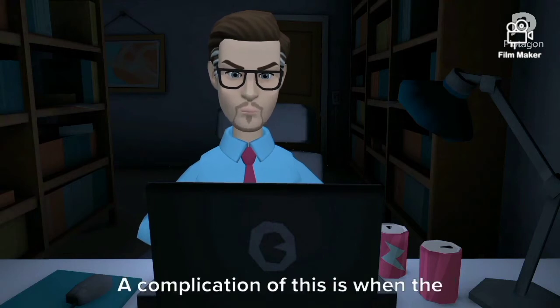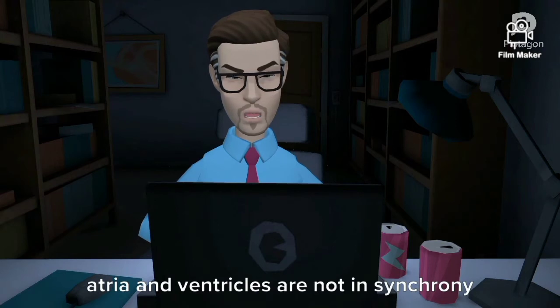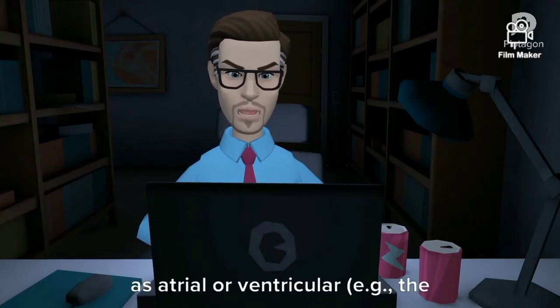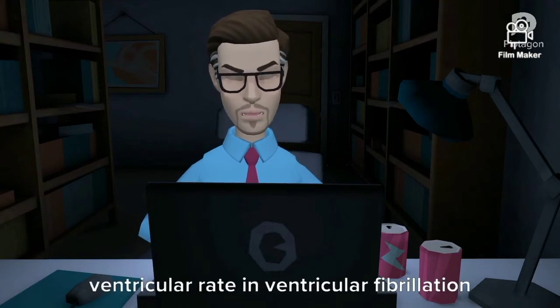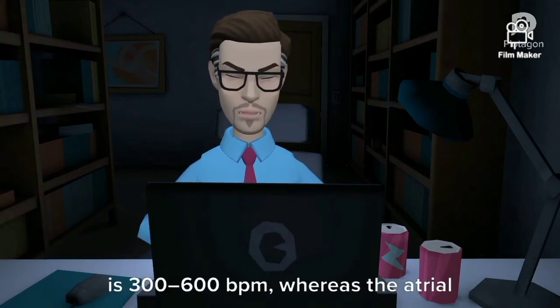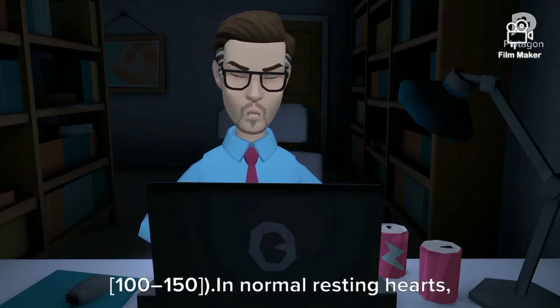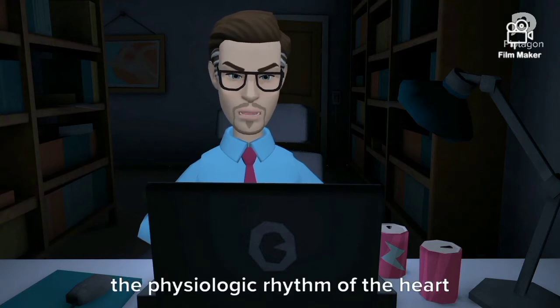A complication of this is when the atria and ventricles are not in synchrony and the heart rate must be specified as atrial or ventricular, e.g., the ventricular rate in ventricular fibrillation is 300 to 600 BPM, whereas the atrial rate can be normal, 60 to 100, or faster, 100 to 150, in normal resting hearts.